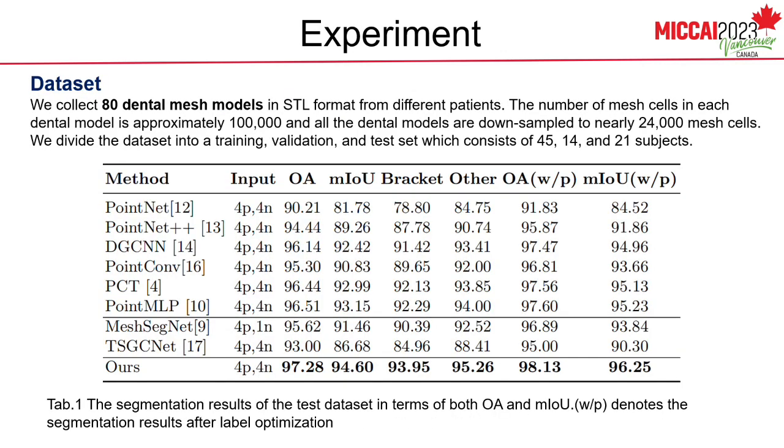We collect 80 dental mesh models in STL format from different patients. The ground truth segmentations are annotated by professional orthodontists. We compare our method with state-of-the-art point cloud segmentation methods and teeth segmentation methods. BSegNet achieves the best performance.